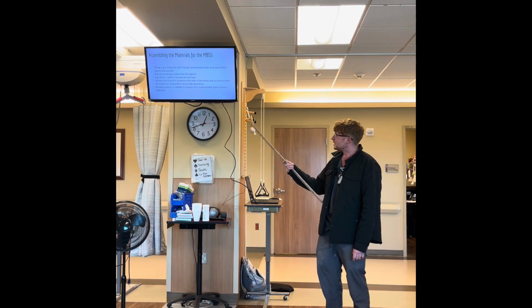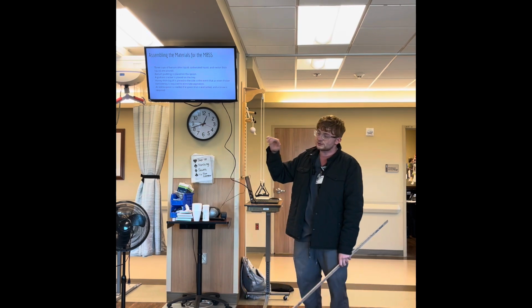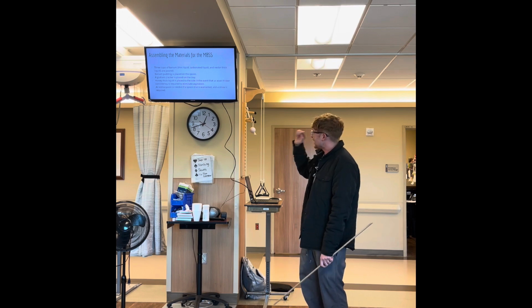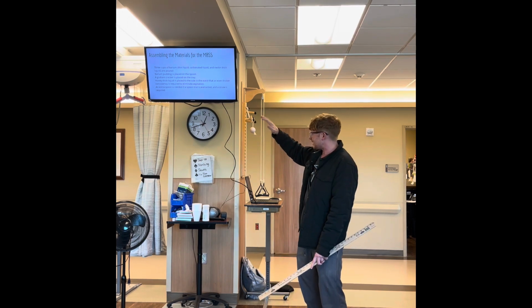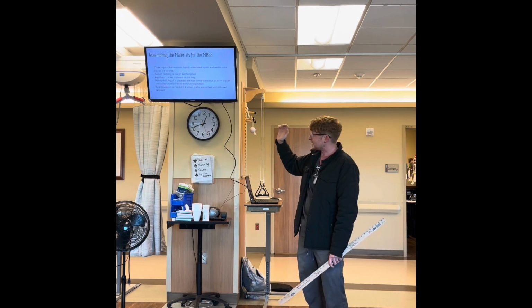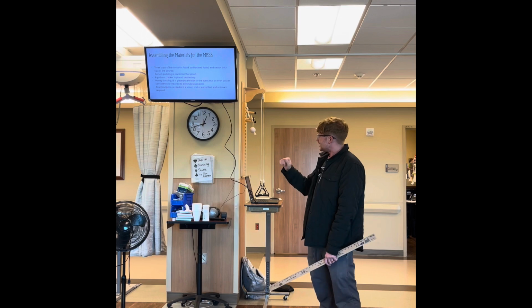We have barium pudding that we put on the spoon, a graham cracker, and then there's a honey thick liquid on the side. I've kind of put it down as not an emergency, but if we're not able to get down the other ones, we have the honey thick there too. It's just even thicker. We're really just trying to see what we can get down safely.